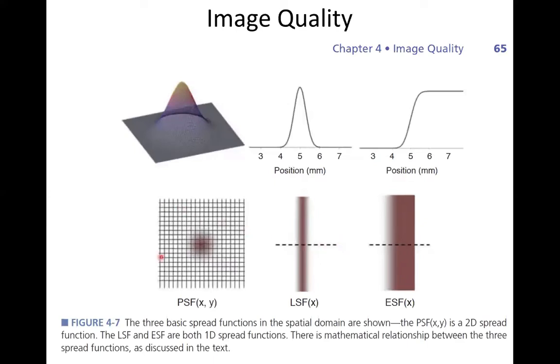So here's the point spread function in two dimensions. Now, recall, if you made this also in the slice direction, in the third dimension, it would be a ball of, in this case, redness, with a central part that's the brightest or the reddest and falling off. For a lot of medical imaging, we just assume that the slice contains all of the signal we're interested in to simplify our life. But of course, that's not entirely true. The z direction, the slice direction itself, will have its own point spread function in that direction. In general, there's a 3D point spread function.